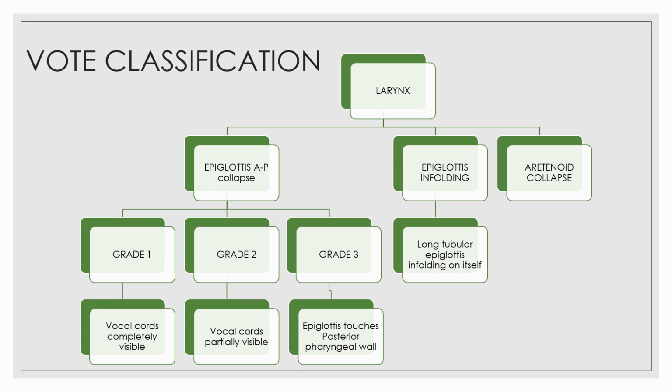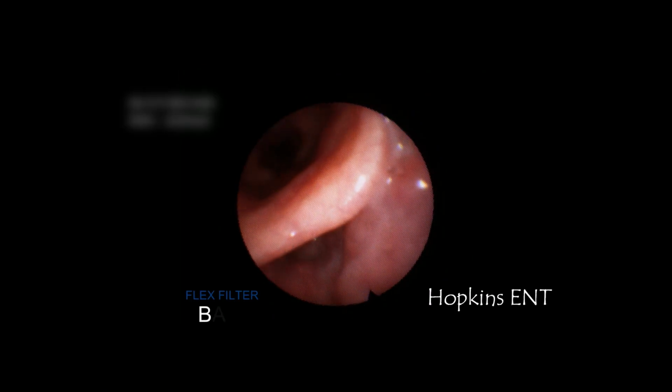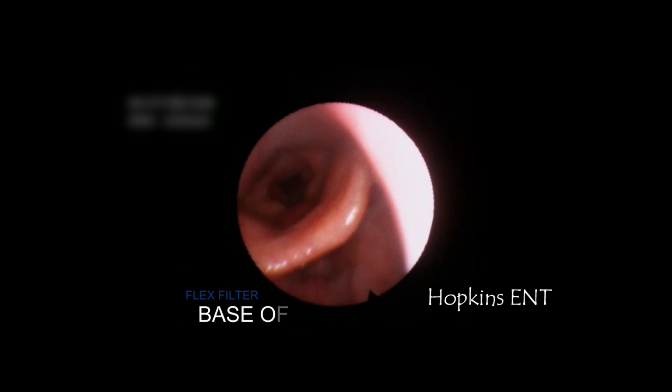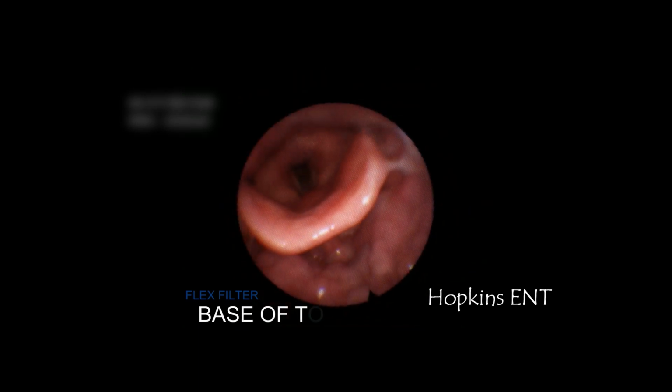And infolding of an elongated epiglottis can happen. That is what we refer to as an infantile epiglottis, which is collapsing, causing obstructive sleep apnea. And then sometimes you can have arytenoid collapse, arytenoids collapsing inwards and causing obstructive sleep apnea. So we have videos again. The first video is a grade 1 epiglottis where you are able to visualize the vocal cords completely while the apneic episodes are happening.